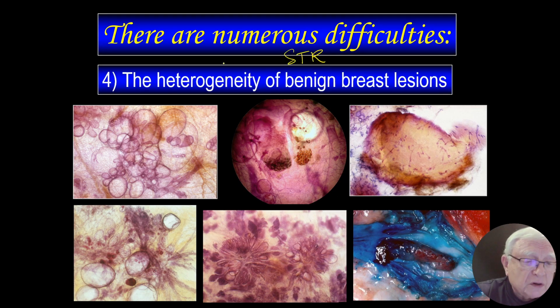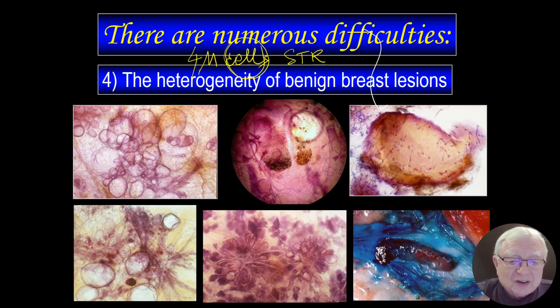So the pathologists, looking at their 4-micron slice, can see cells. We radiologists go to a meeting with the pathologists where the colleagues are only talking about cells. When was the last time you saw cells on the mammogram? Never. MR, ultrasound.